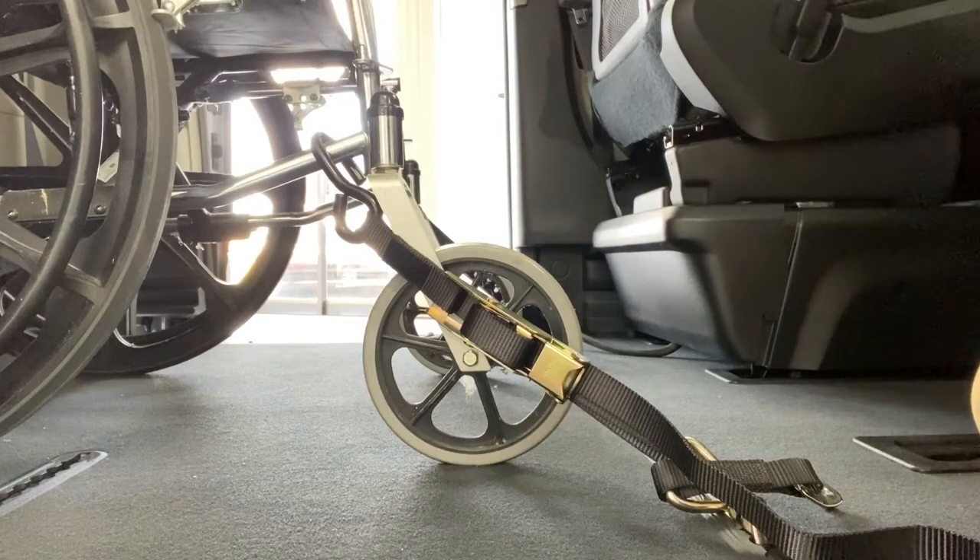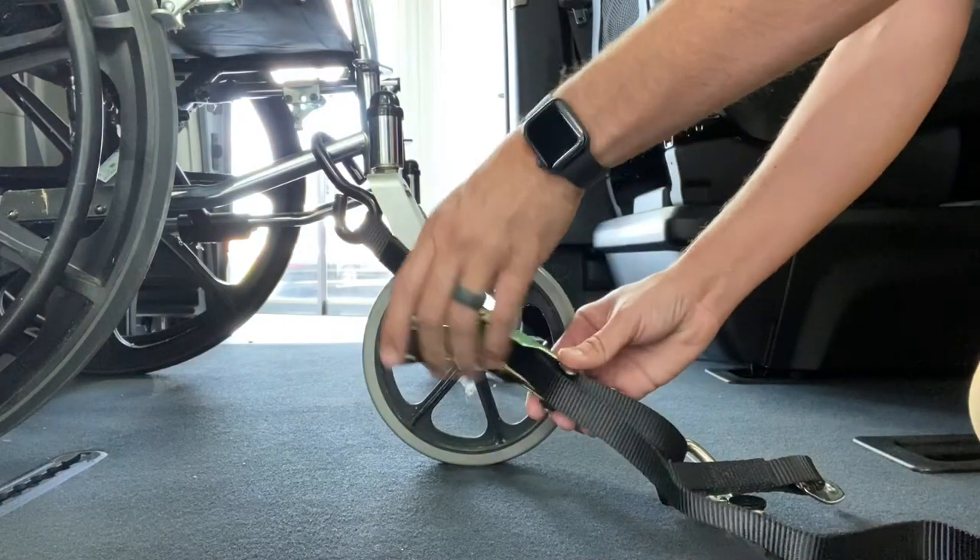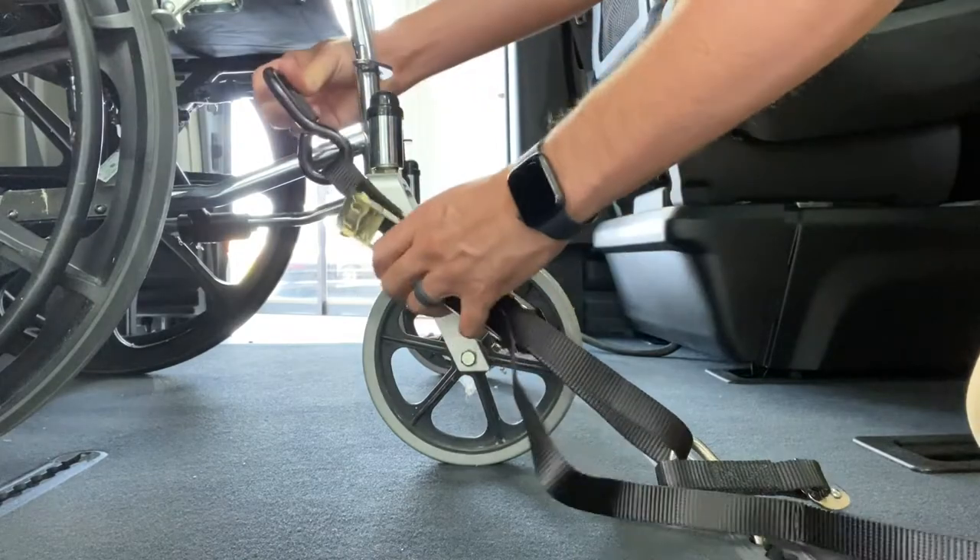To operate the manual tie-down, put the J-hook on the chair, pull back the tension, and pull down on the cam lock.